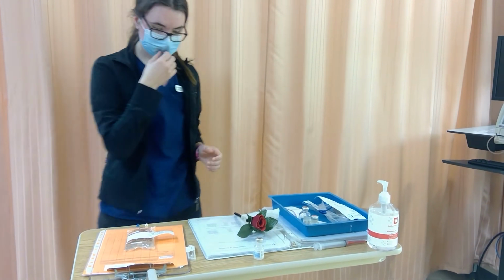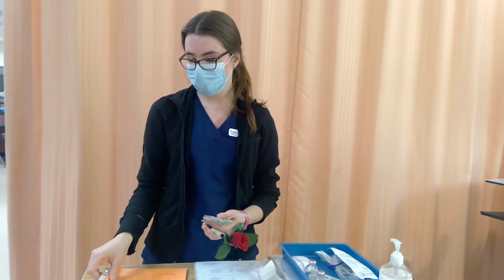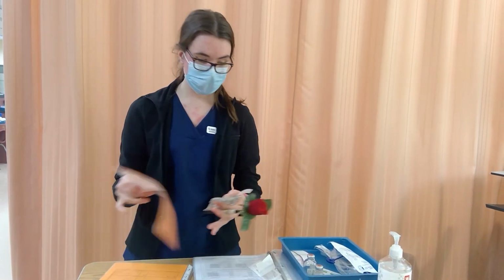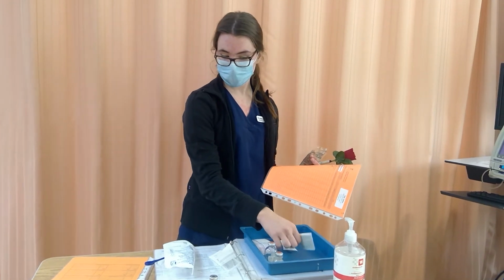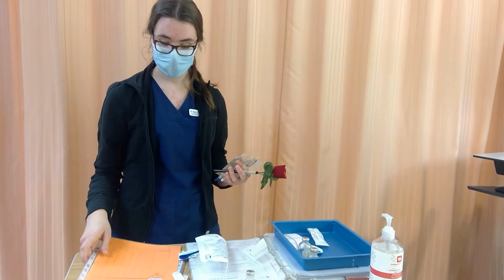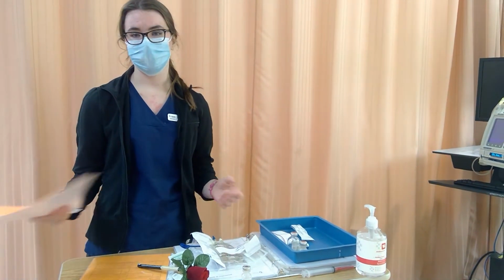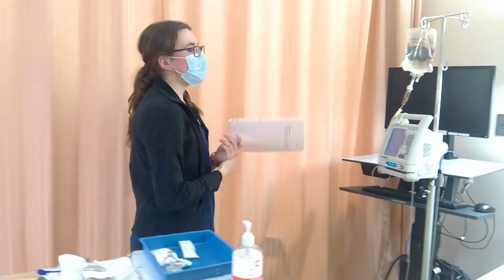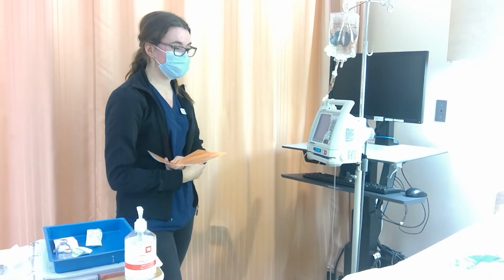Now we have that. So now that I have my medication, I'm going to grab my MAR, a pen, my secondary tubing, and an alcohol swab. And I'm going to take those into the room, but for the sake of the demo, we're already in the room, so I'm just going to take my MAR off the table just to start off, okay? So I'm going to enter the room. Hi, my name is Melannie Teitsma. I'm going to be your student nurse for today. I'm just here to give you your medication, alright?